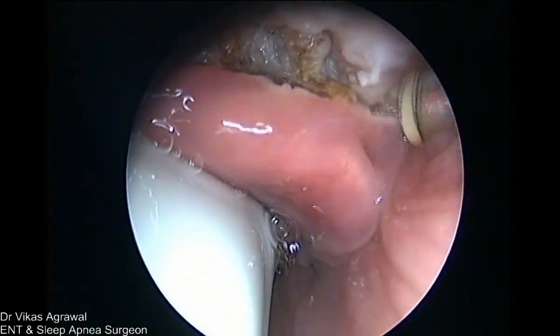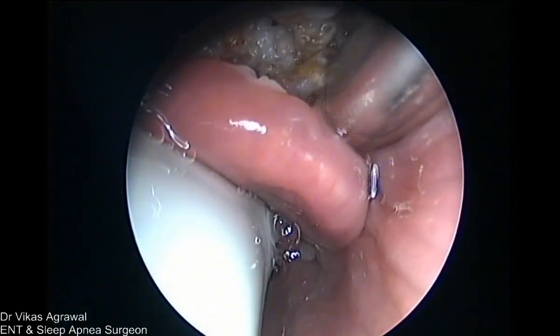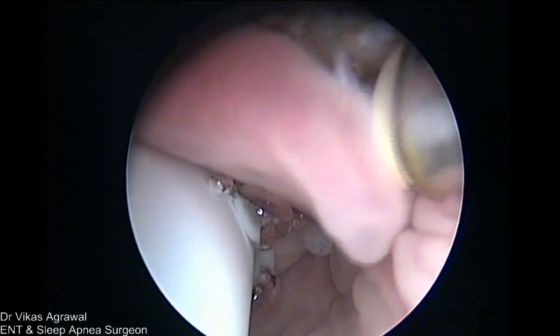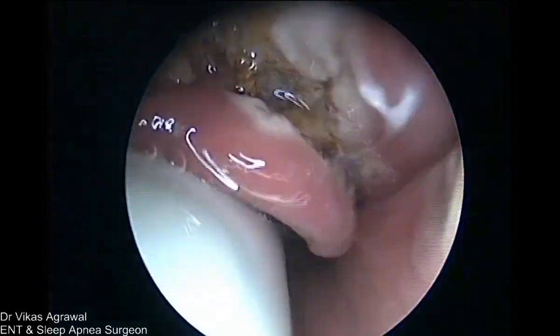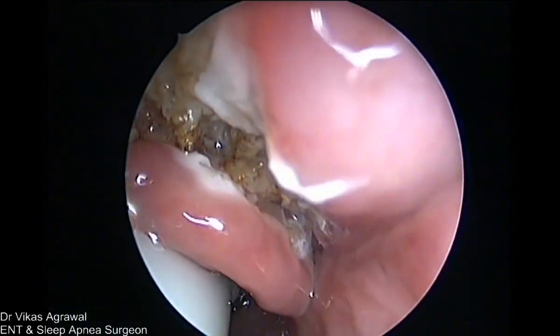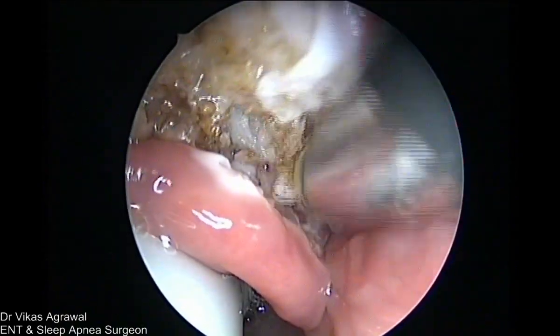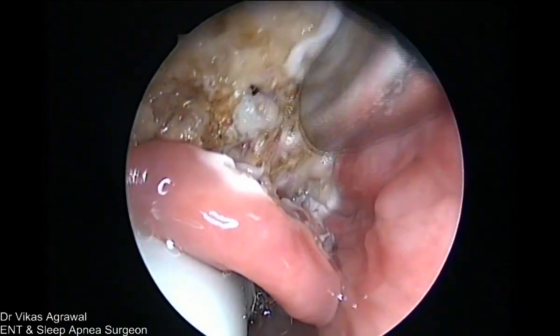Now see what I'm doing. I'm going onto this mucosa, making it raw at the same time. Can you see that? Seen. So this will cause glossoepiglottopexy. Once you create a raw area on the tongue, can you see that? Seen very well.